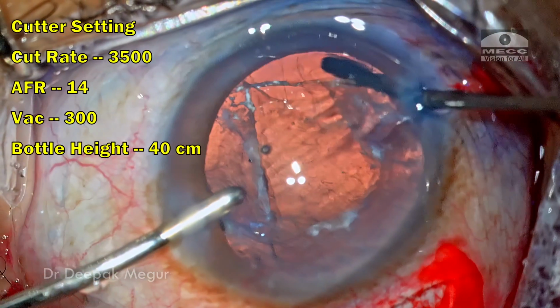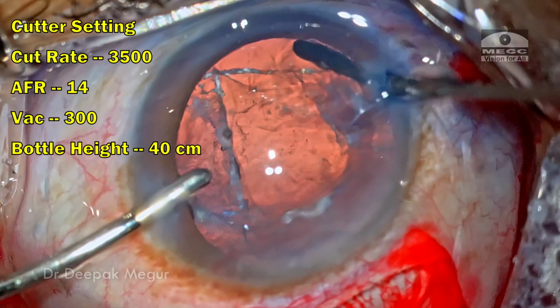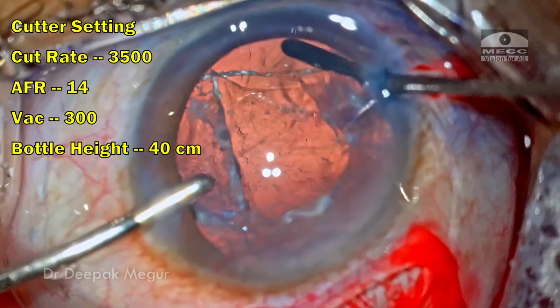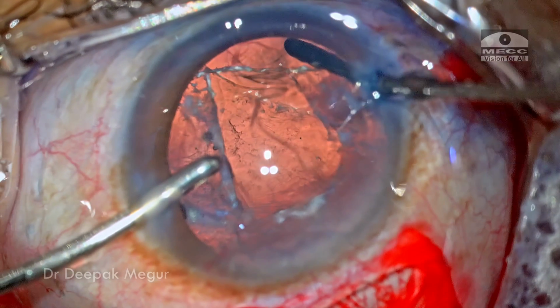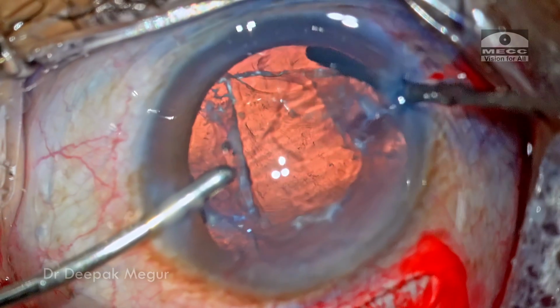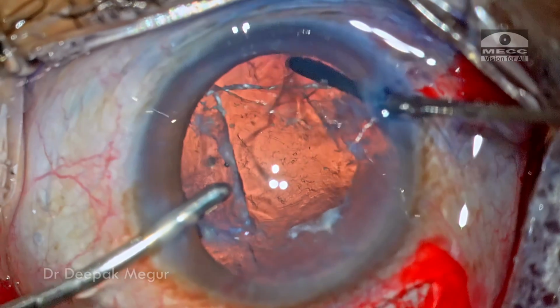The cutter is placed through the clear area where the zonules were absent and the irrigation is held through the opposite side port. I'm going to do a limited anterior vitrectomy, just clear out the vitreous beneath the posterior capsule and around it.